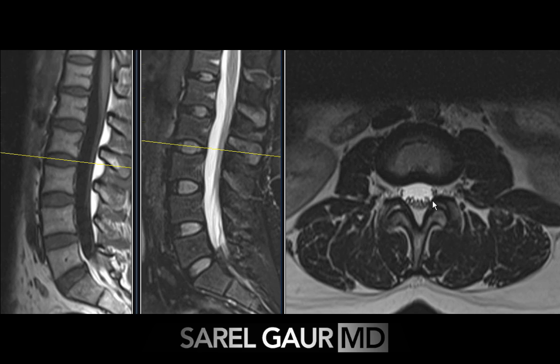I'm looking at the thecal sac, which is the fluid-filled sac that contains the cauda equina nerve roots. It should have a round configuration. I'm looking for any narrowing of the central canal region, and looking for anything else that will cause narrowing, such as ligamentum flavum hypertrophy or facet enlargement. I'm also looking at the epidural fat to see if it's impinging on the central canal and causing stenosis.